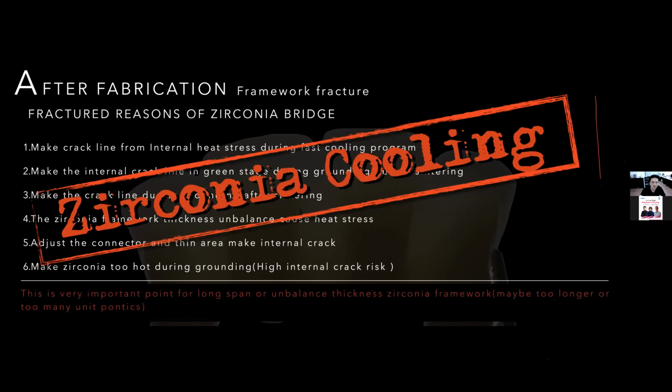So the very important thing is to make your zirconia restoration bake every time with the slow cooling procedure, especially the long span or a bigger restoration.